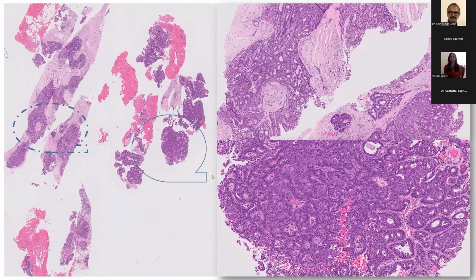Now let's look at this VAP. And you can see there are two different areas. This lesion, maybe I will think that this is again not looking very papillary because it's a solid proliferation. And I'm worried about these two areas, this area and this area. Why? Because they are monomorphic. So anything in a papilloma that is monomorphic worries us.